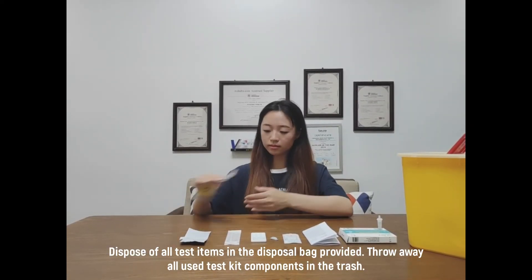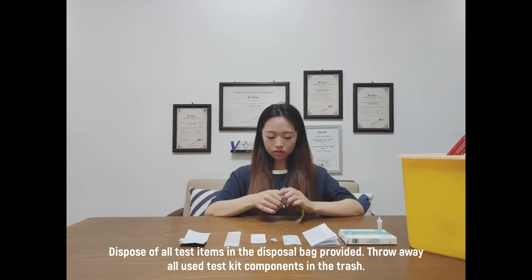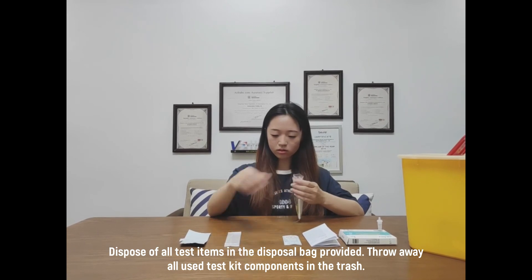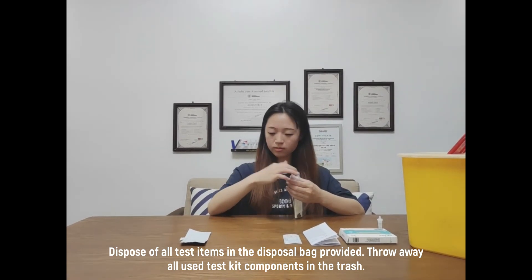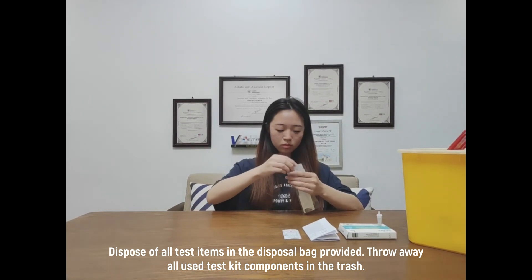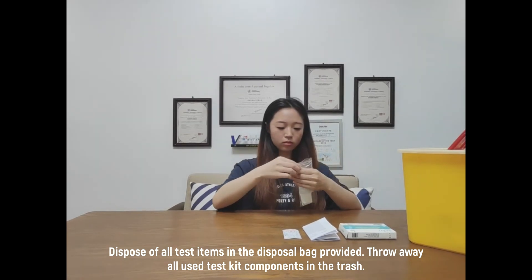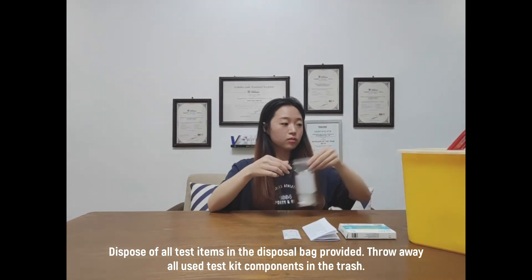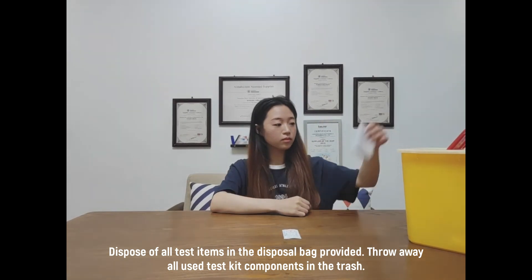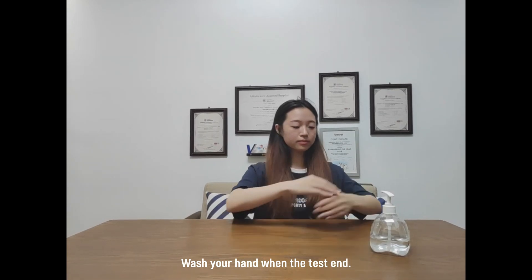Dispose of all test items in the disposal bag provided. Throw away all your test kit components in the trash. Wash your hands when the test is done.